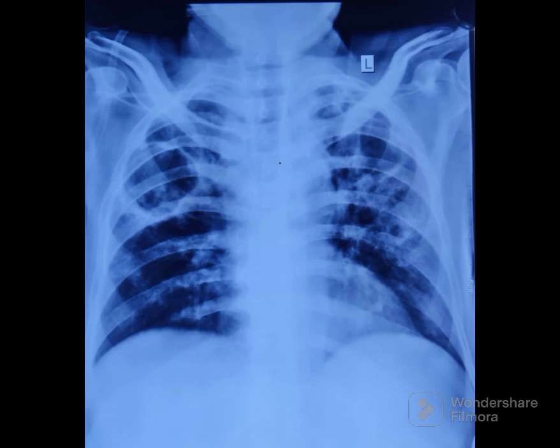Observe the lung parenchyma surrounding the cavity. If there are consolidations or tree-in-bud nodules, it favours a benign etiology. Presence of a mass lesion in the same lung or opposite lung favours malignancy.